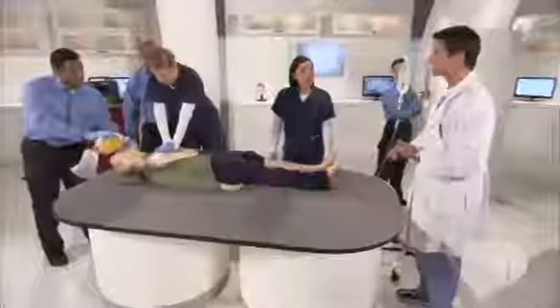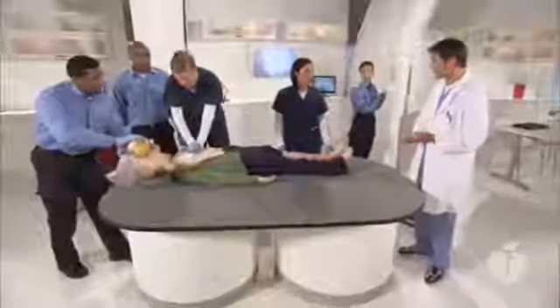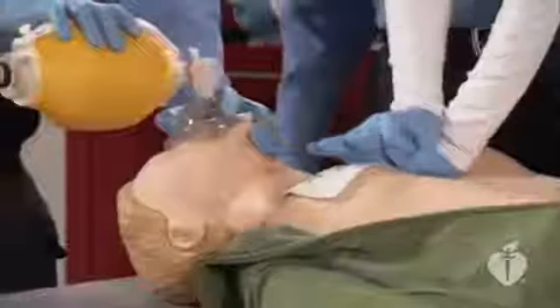Great. We'll continue CPR for 2 minutes and evaluate the need for additional defibrillation. Shelley, I'll rely on you to monitor the quality of the chest compressions. Dana, you'll need to draw the drugs up before each rhythm check, so if the arrest persists, we can move quickly to drug therapy. Let's begin with 1 milligram of epinephrine. Drawing 1 milligram epinephrine. 2 minutes. Okay, let's analyze. Switch roles.